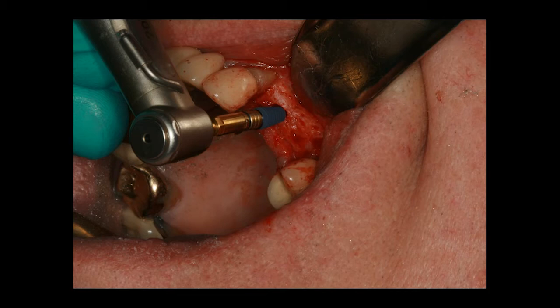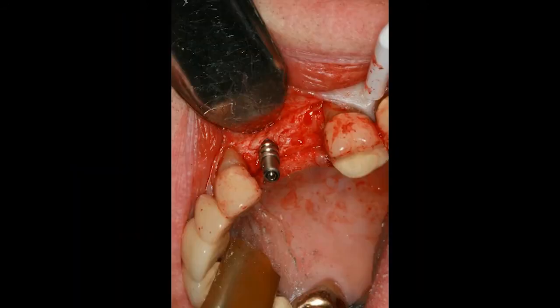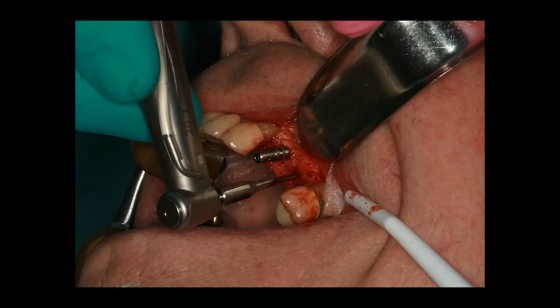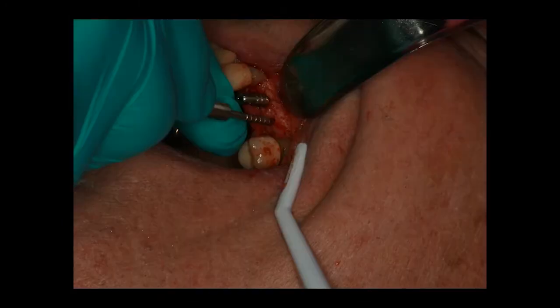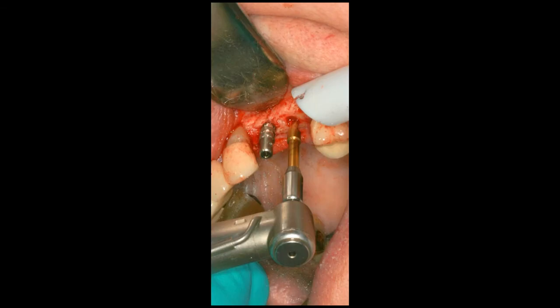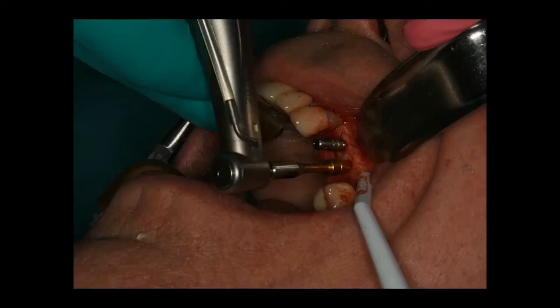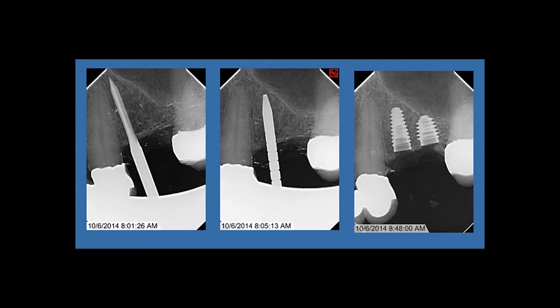Here we're placing an Any Ridge implant in the first bicuspid site. I'll put an extension on so we can look at the line-up, then start creating the osteotomy for the second one — it's a tight spot. After enlarging that osteotomy, we go ahead and place the second implant. Now we have both implants in place. The nice thing about platform switching is you can get a little closer to one another than with non-platform-switched implants.